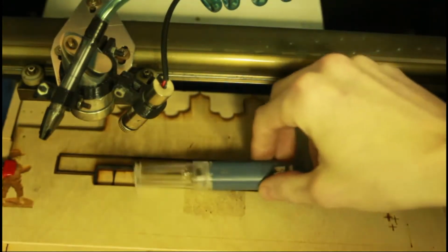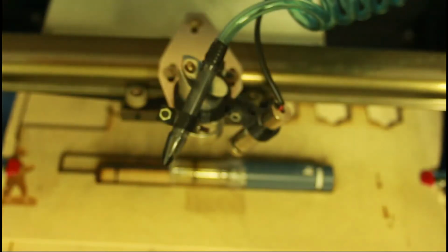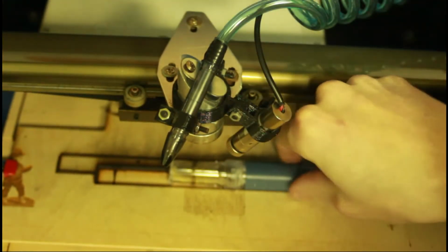If you're interested, by the way, in the kind of laser that this is, it's a K40 laser, just some cheap laser I got from eBay from China. It's a little quirky, it's a little hard to work with sometimes. It's not the most convenient product out there. There are probably better lasers you can find now. I got it years ago, but it's still pretty reliable for the price, and for a first laser cutter, I do recommend it. I'm going to turn it over a few times in order to get each side because this thing doesn't do any rotations on its own, unfortunately.